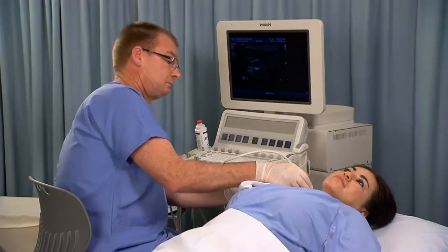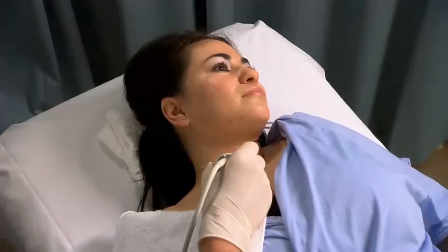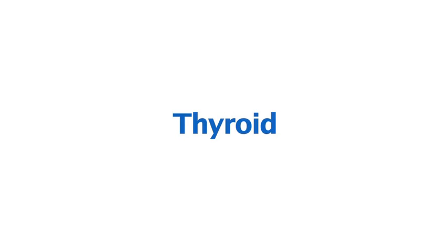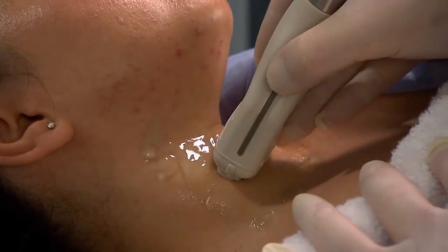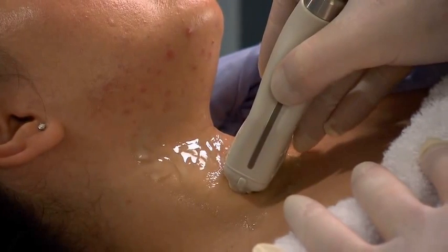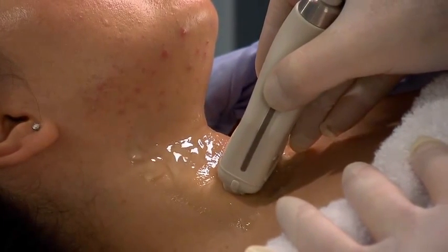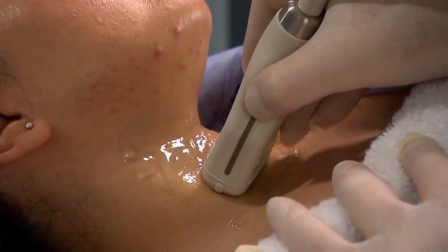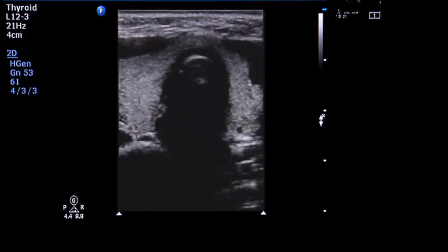Perform a survey scan of the neck and make the necessary adjustments to the machine settings to maximize image quality. Once complete, proceed to scan the thyroid and parathyroid glands. Place the transducer over the anterior neck area slightly off the midline in the transverse plane, and manipulate the transducer until a suitable image of the thyroid is obtained.